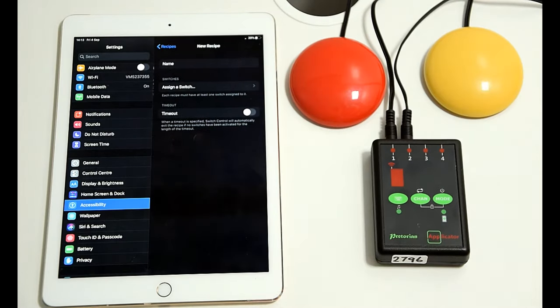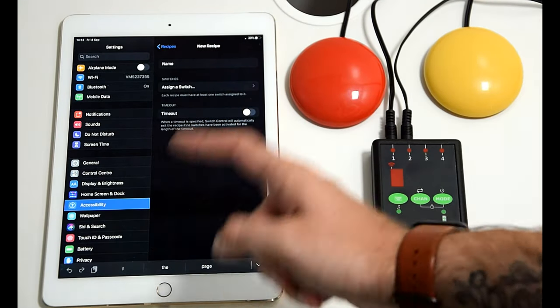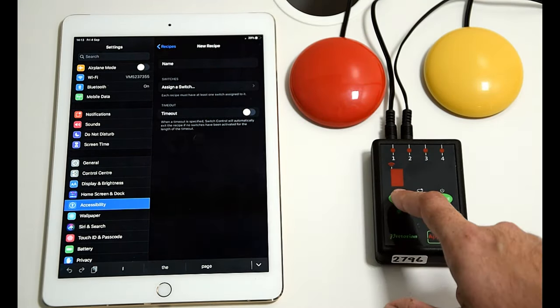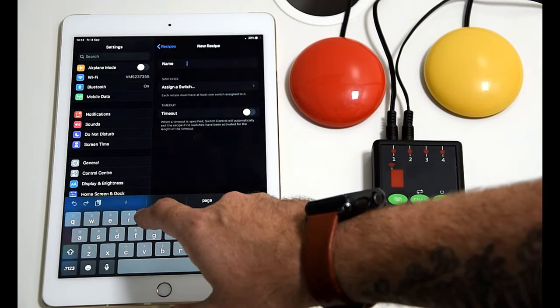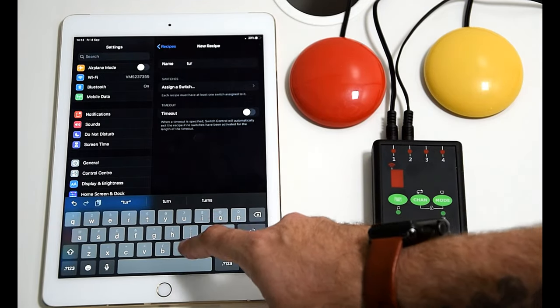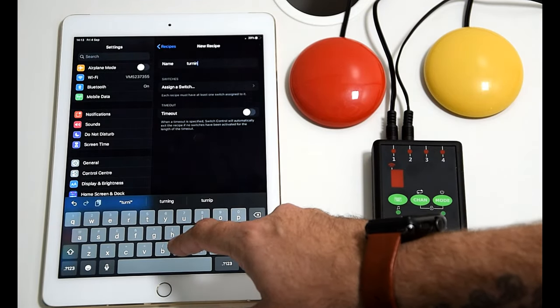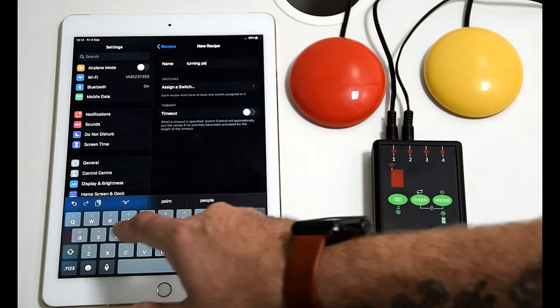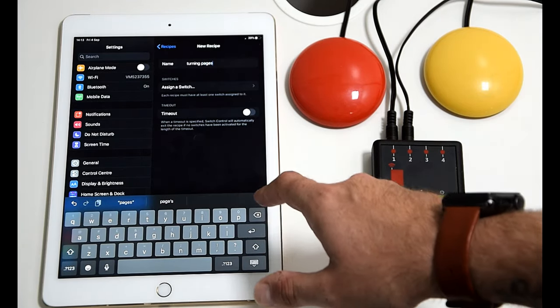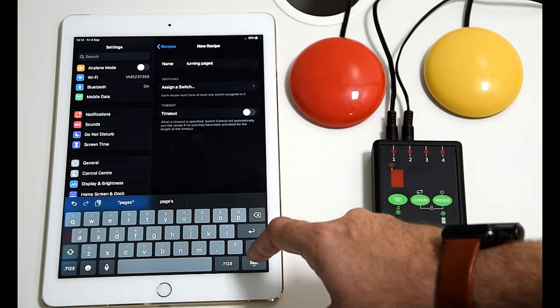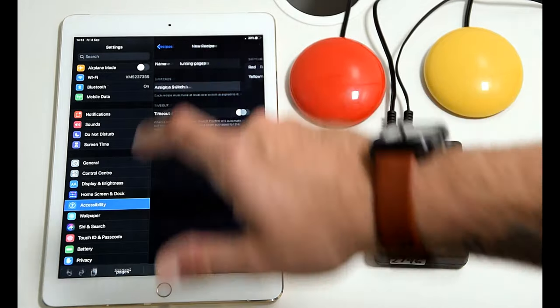We want to create a new recipe and this recipe, you can call it whatever you like, but we're going to call it turning the page or turning pages. Now once you've done that, you assign your switches.